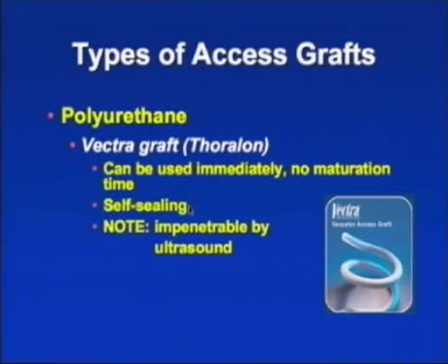It's also self-sealing, but it's important to note that this graft is impenetrable by ultrasound. So when we try and evaluate this type of graft, we can't get any ultrasound through the graft, so we have to assess the inflow into the graft and the outflow to determine any stenosis or occlusion within the graft.